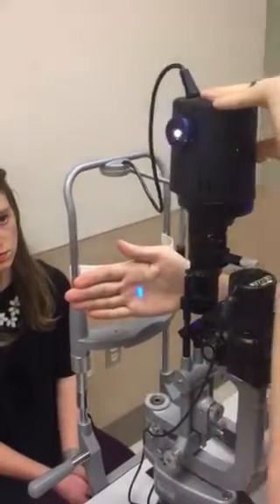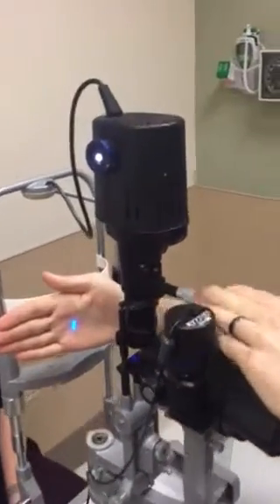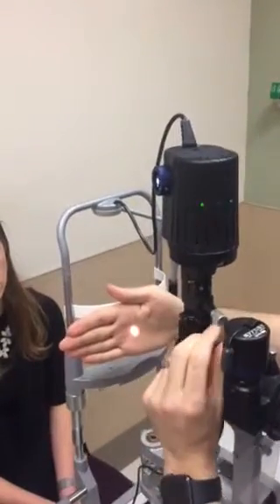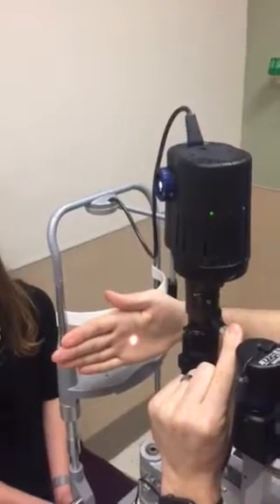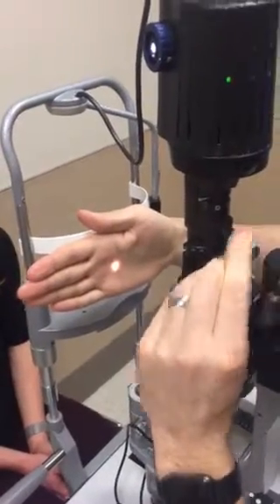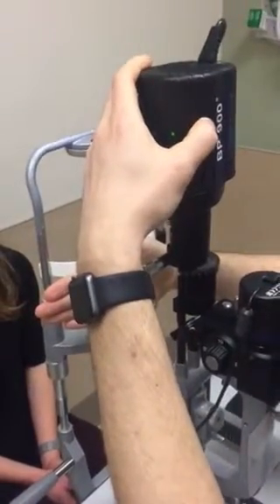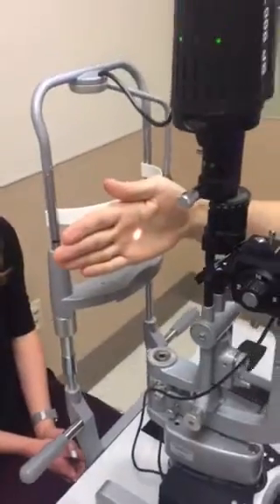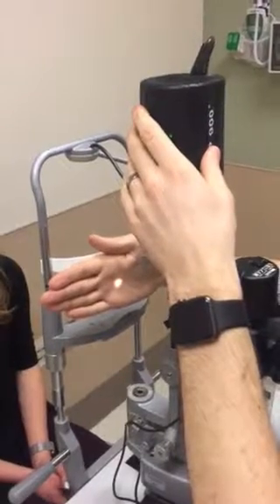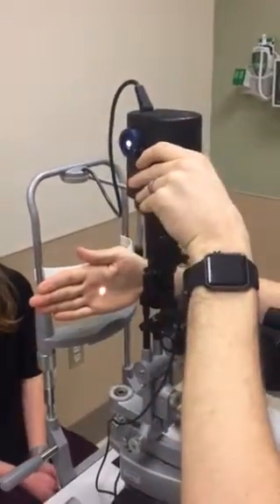Using this knob, which controls the blue light filter as well as the length of the slit, you can do measurements. As I turn it, the beam gets shorter — at that height the beam is five millimeters, and further down that's three millimeters. This gives you the vertical axis, and turning it the other way gives you the horizontal axis. So if you're measuring a corneal abrasion or ulcer, you can focus on the cornea, get the measurement, and give that to the ophthalmologist when you consult — it changes their treatment plan based on the measurement.